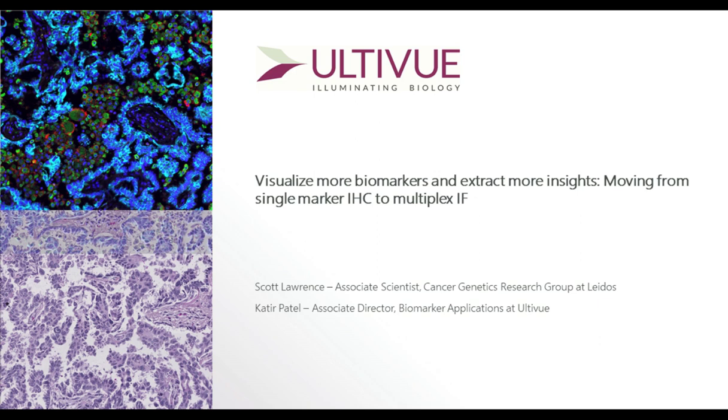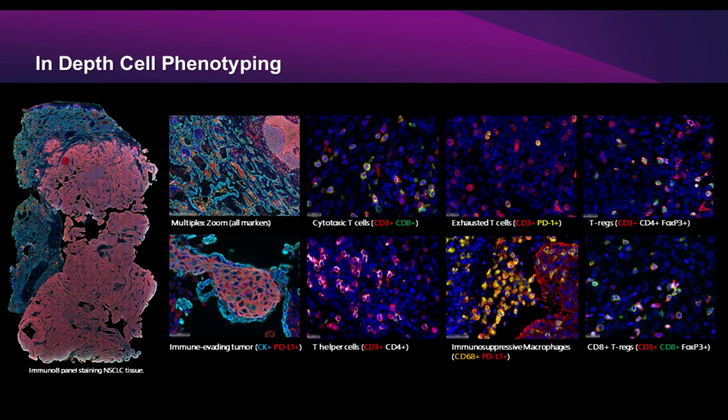Yes, we absolutely can. If you take a look at the end of Scott's presentation, you can actually see a couple co-localizations of multiple markers in different cellular compartments, such as looking at Tregs, for example. We have CD3, CD4 as surface markers, but you're also detecting FOXP3 as a nuclear marker as well.